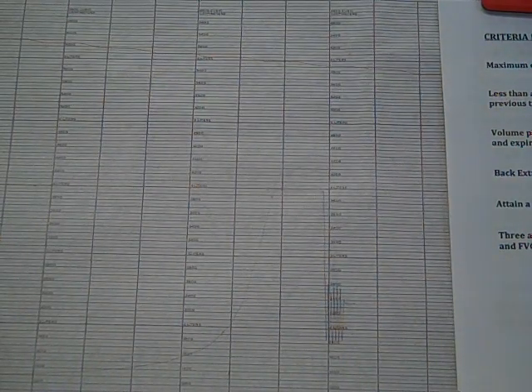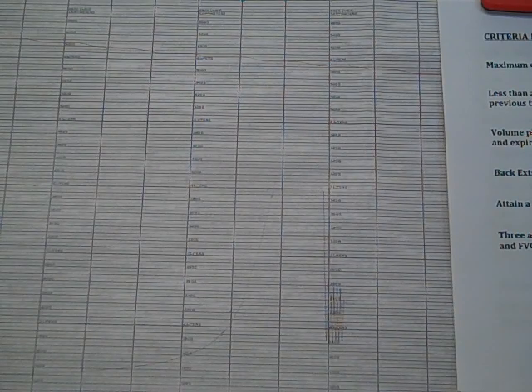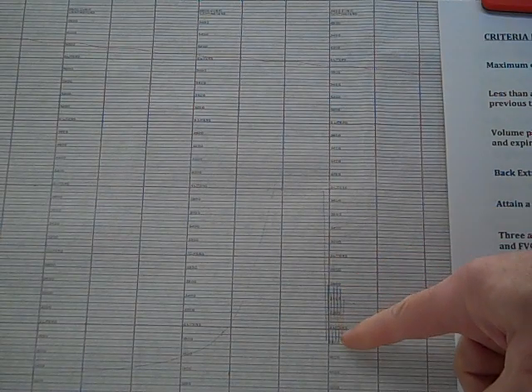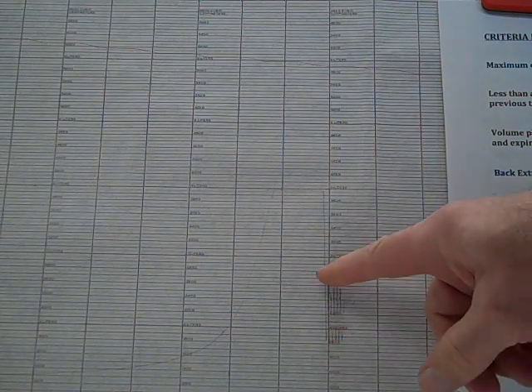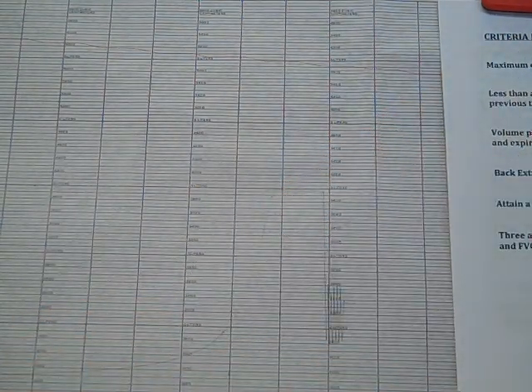This is a spirogram taken from a 13.5 liter column spirometer. They also make the 7 liter spirometer. So for the 13, we'll need to double the figures on the paper. So just keep that in mind. This is a typical spirogram with tidal volumes, the inspiratory, and then the hold, and then the fast exhalation with a forced exhalation for at least 6 seconds.